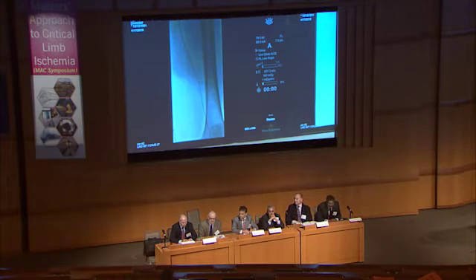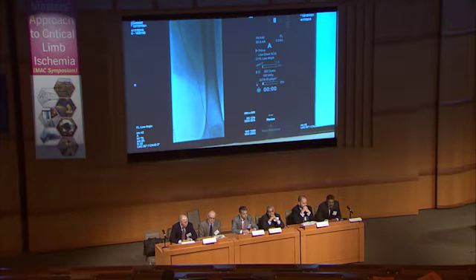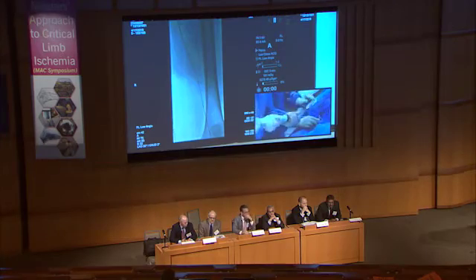Well, I would start with pre-dilatation with a sufficiently sized plain balloon in order to establish flow through the SFA and then re-evaluate the location and significance of the AV fistula. Depending on that outcome, I would decide how to proceed, whether using drug-coated balloons. If there are multiple AV fistulas present, I would not use a DCB, except probably in potential landing zones of the Viabahn, but then I would go directly to Viabahn implantation.